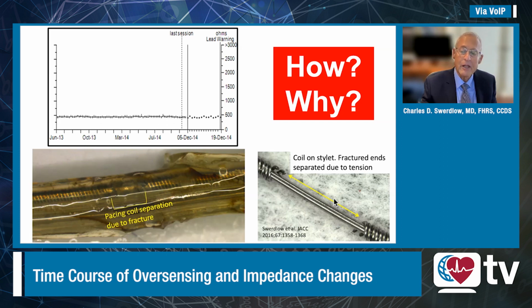And so my colleagues and I performed this in vitro study for two reasons. First, to answer the question, what's the structural state of a fractured lead when alerts are triggered, either oversensing alerts or impedance alerts? And secondly, how can we use what we learn to design better device lead diagnostics and to improve how leads are tested preclinically? Okay, great.